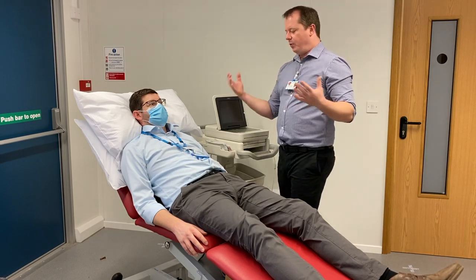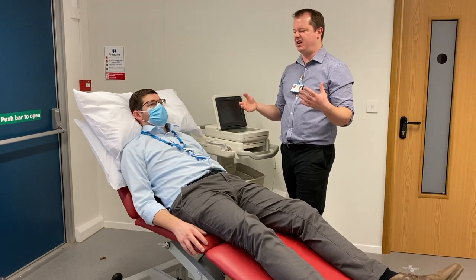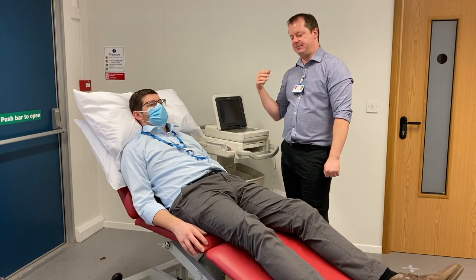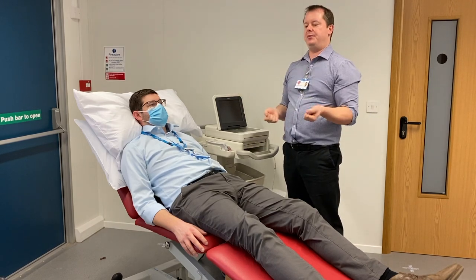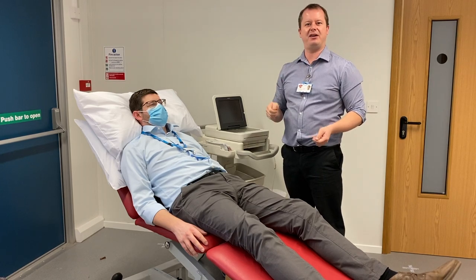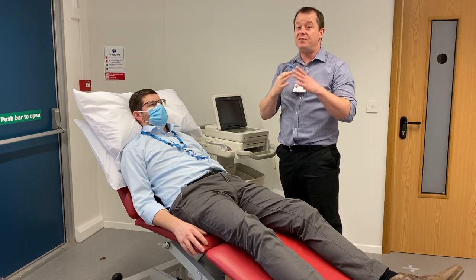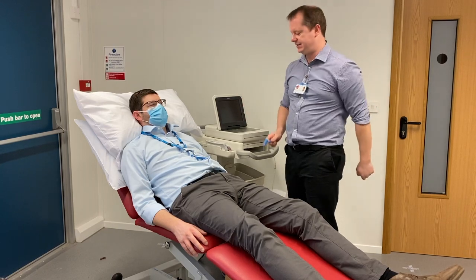Before we do the procedure, we need to look for any hazards that will get in the way or cause a poor signal. On a man, or maybe a woman, you might find a really hairy chest — stickers won't stick well to hair, so we need to razor off some of those hairs. There are razors available for this. We're not shaving a completely bald chest — just shaving small patches where we need to stick our stickers.